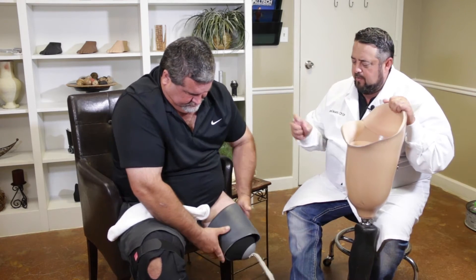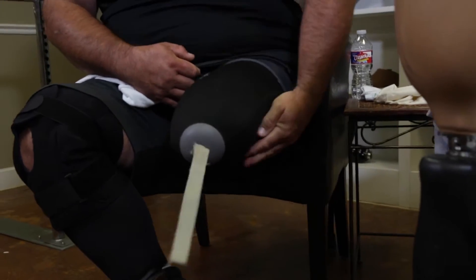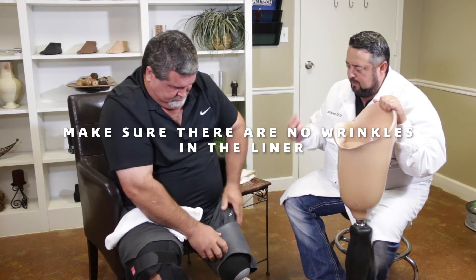After you've worn it for a little bit it gets a lot easier to put on and take off. You want to make sure you don't get any wrinkles in it at all. If you get any wrinkles in it, then wherever the wrinkle is, it will cause a blister on your residual limb.